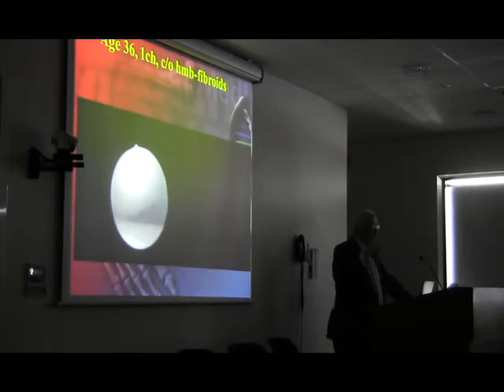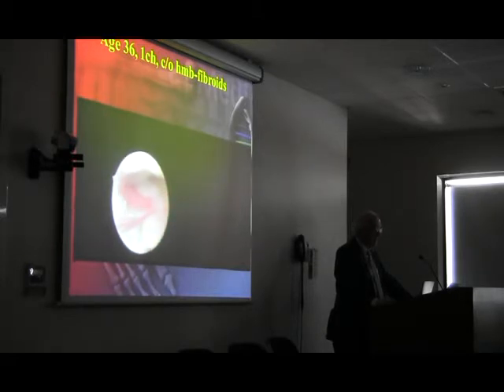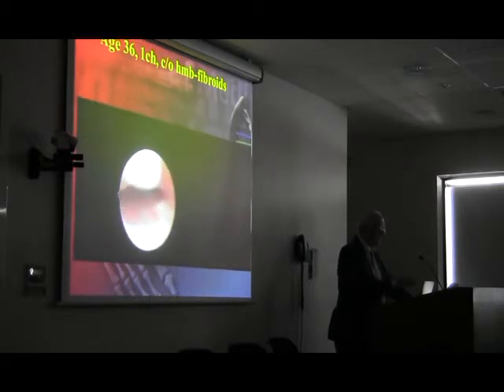So again, you're looking now at the scope in the vaginal approach. In the vagina there are often little bits of mucus, and the mucus will bring you to the cervical os, and then you see the difference. In you go, and at this stage you've got to change the trajectory of the scope and just move it along. Again, the same way, you can see the opening at the end, so you can see where you're going, and the little push, boom, at the end, just to get you through into the cavity. So she'll feel this. You say, you're going to feel this, bang, and in you go into the cavity.